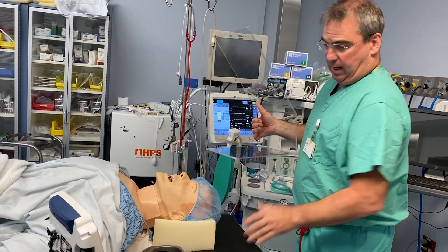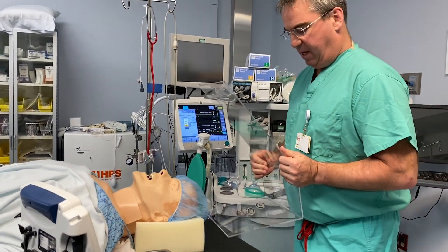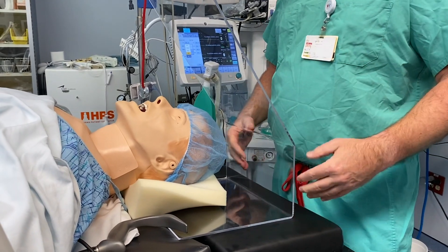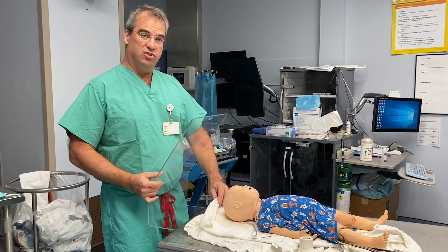It can be placed from the side as well. So instead of coming from the head, it can also come from the side. That may have application for different kinds of beds such as a fracture table that has a block here. It works in all sizes.